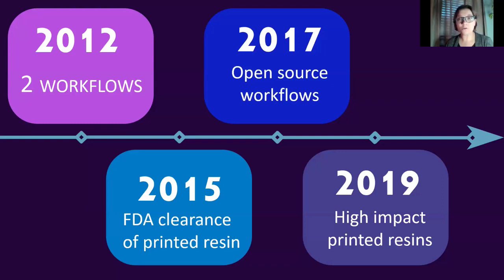The home computers became much more affordable and feasible for a private practitioner to purchase, especially the machines that are big enough and powerful enough to run the design softwares. Next, we had the FDA clearance of resins in 2015, which again became commercially available around 2017.